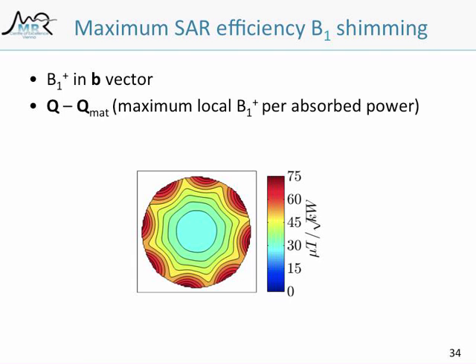And that's what, in the end, when you're doing a real experiment on the scanner, should matter, because who cares about all the losses that don't go into the patient? That's not your limiting factor. You're limited by SAR and maybe by the transmit power. But this again gives you a nice global overview of how the coil array can perform, not just based on the single channel fields, but actually on a global scale.